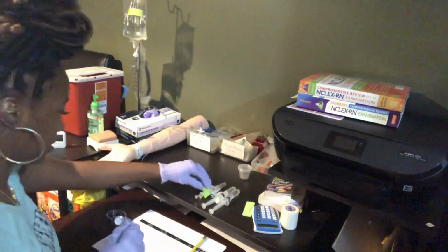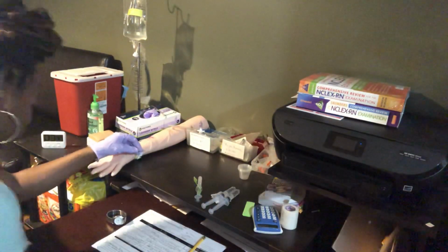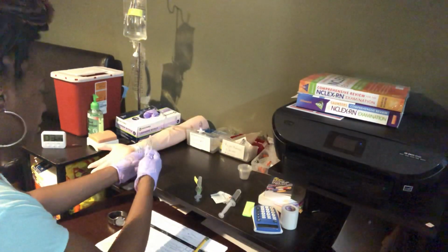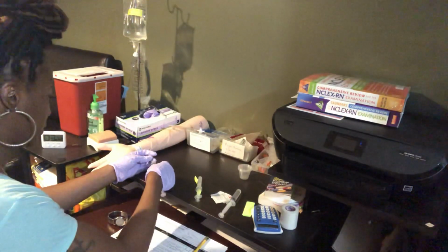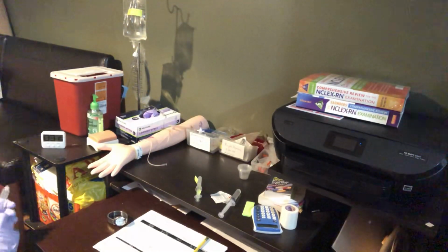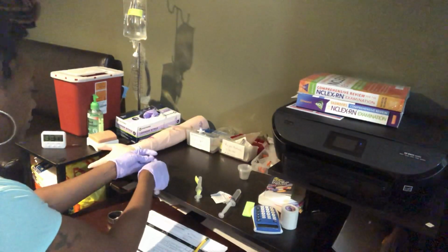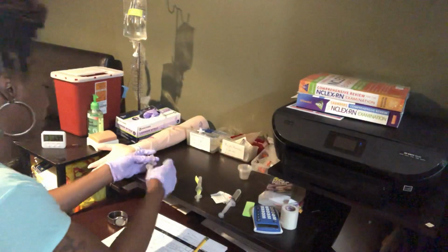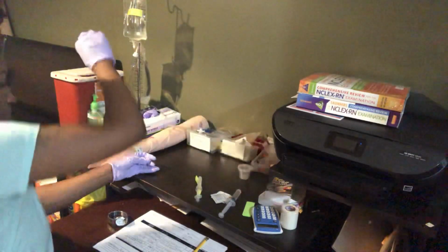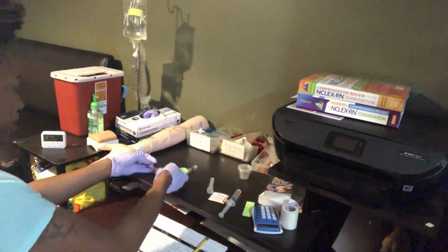Okay, so now I'm gonna give the medication. Clean the port, throw that away. Normal saline, 1 milliliter, and I'm going to, oh, this is not even 1 milliliter. I got to get this to 1 milliliter. I don't have my cup over here, so act like I got that to 1 milliliter. I'm going to aspirate. Got the blood, push it in there, put it in the sharps container, clean the hub again, get the medication, get it in there over 1 minute.